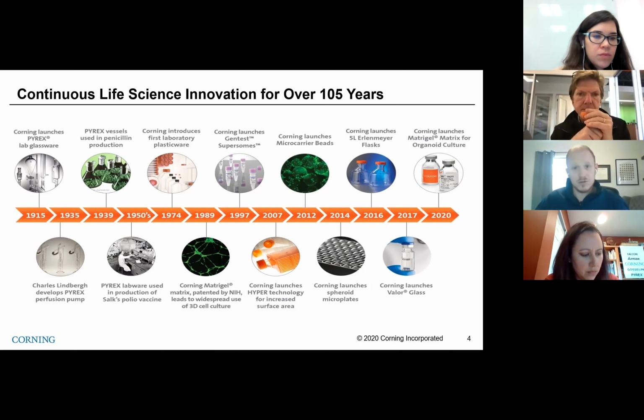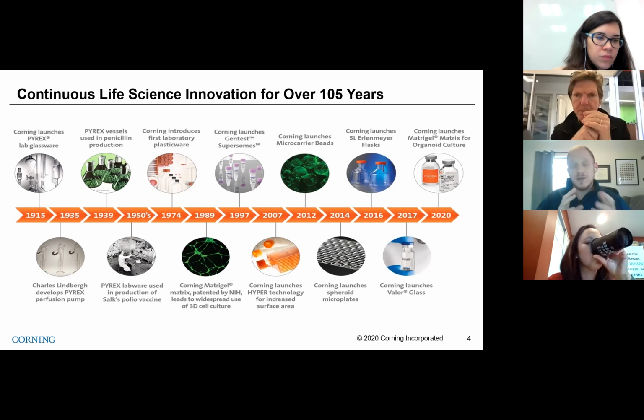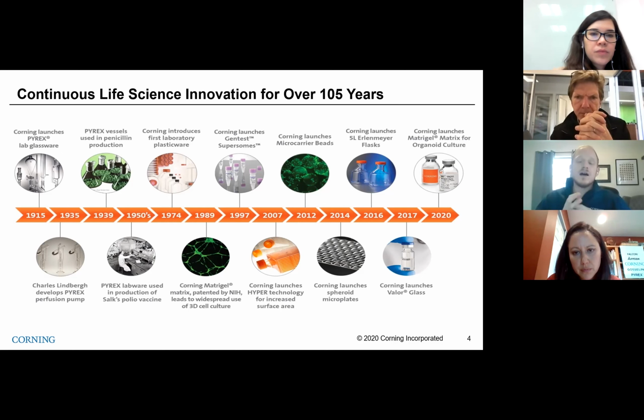Your classic tissue culture is in a 2D environment where the cells are adhered to a flat surface. These days, there are many more advanced methods of culturing cells in 3 dimensions as spheres. And then other more specialized products as well for scaling up suspension cells, like larger Erlenmeyer flasks and items for culturing organoids.